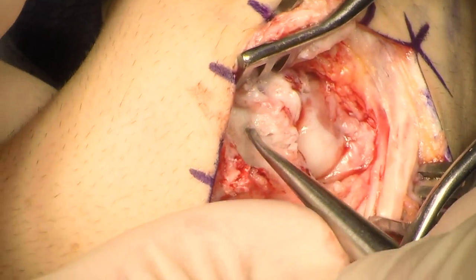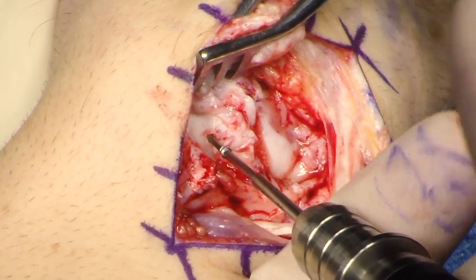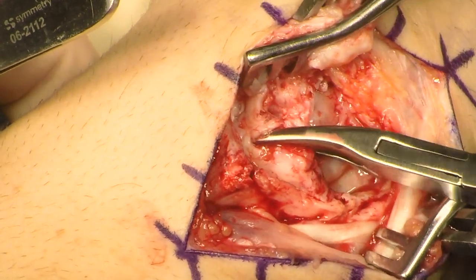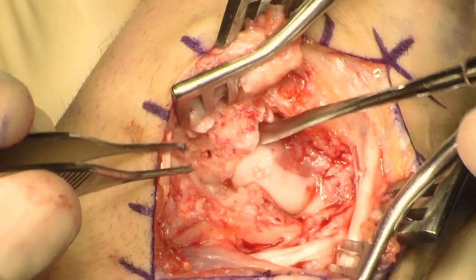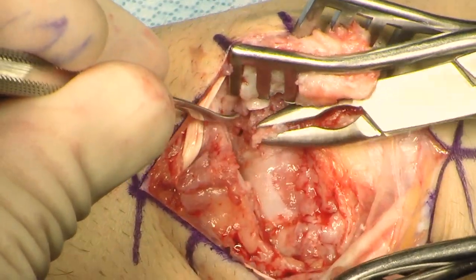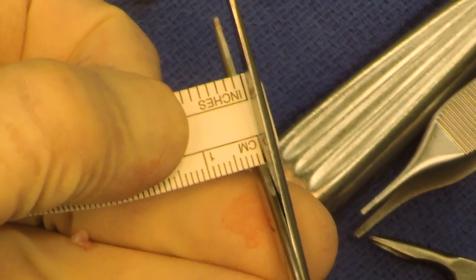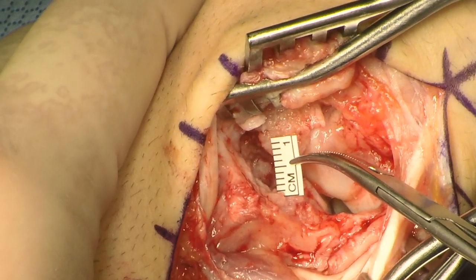The scapholunate joint is identified, and the scapholunate ligament is elevated off of the proximal pole of the scaphoid. The scaphoid is identified and then removed. The proximal pole of the scaphoid is removed using a rongeur. The scaphoid is examined; there is an osteophyte on the dorsal aspect that was debrided. A ruler is trimmed and the defect is measured.